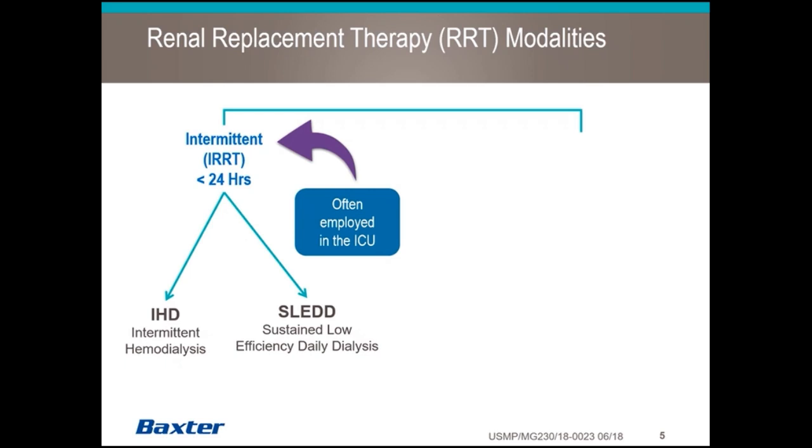The fluid removal is accomplished at a slower rate. Fluid is administered at a slower rate. Solutes are removed slower and more gently. So for patients that are less stable, in many cases they can tolerate SLED when they can't tolerate IHD, so it's often employed in the ICU as well.